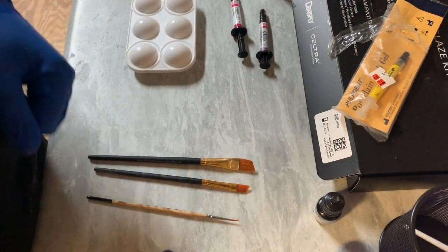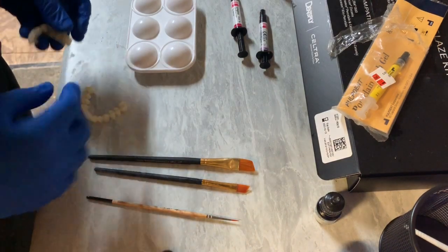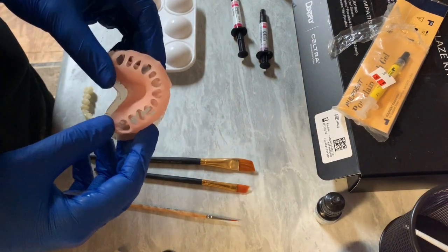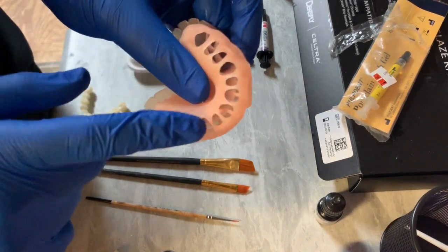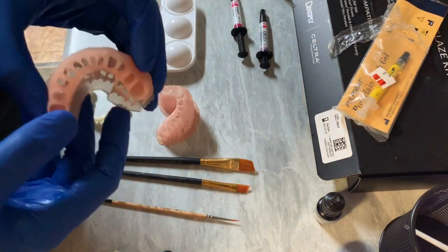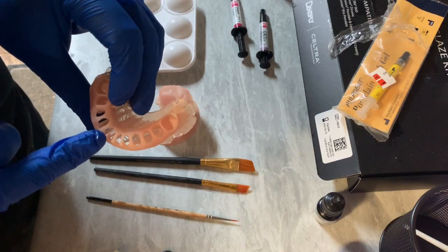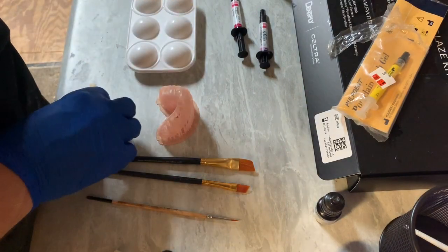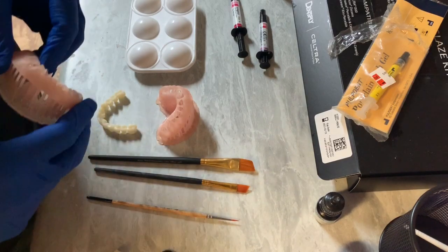Hey gang, Matt here. Sorry for the noise — it's a work day so I got the compressor going. I have a case here of immediate dentures and he didn't have a whole lot of room, so you can see there's show-through through here. I'm going to show an example of how I kind of set these up. They're still on the base — if these were closed I'd go ahead and snip these supports off, but because I still need to bond teeth in, I'm going to hold off on that part.